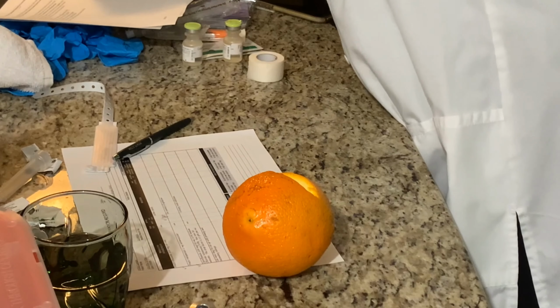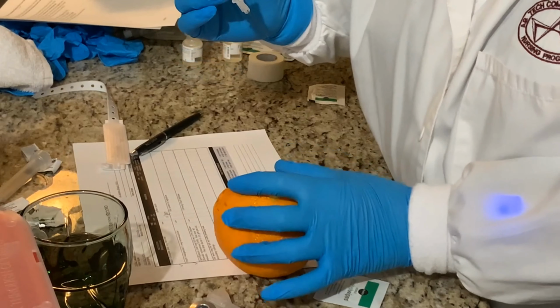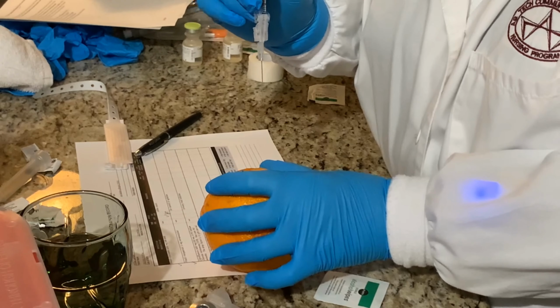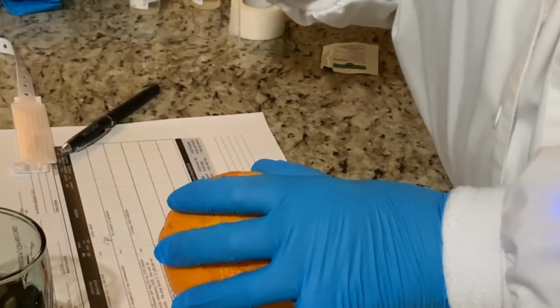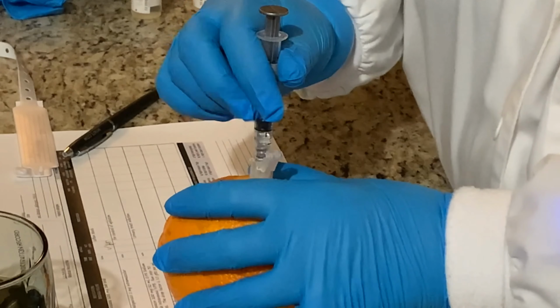Okay, Millie, I'm ready to give your injection. I'm going to pull the skin taut. Don't squeeze it for IM. Pull it taut. Any IM injection is always 90 degrees. You don't have to aspirate unless your policy at your facility tells you to. 1, 2, 3. I'm going to go straight in.